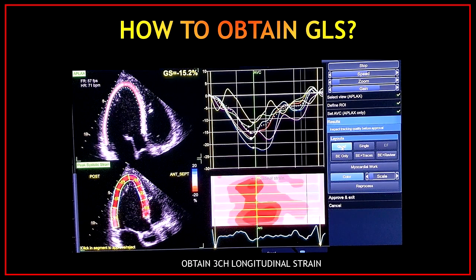By clicking process, you will obtain the three-chamber longitudinal strain. This is the longitudinal strain of just one view. If you want to obtain the global longitudinal strain, you have to do the same process on the rest of the views. To get the global longitudinal strain, you will need to obtain the longitudinal strain of all three different views: the three-chamber view, the two-chamber view, and the four-chamber view.